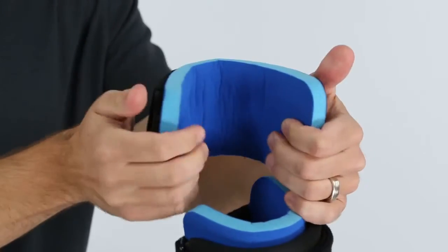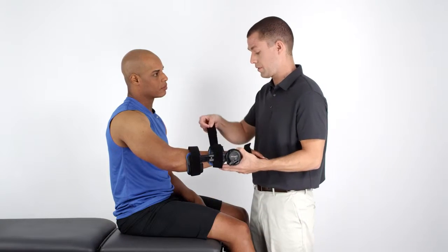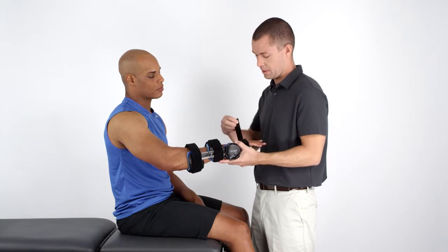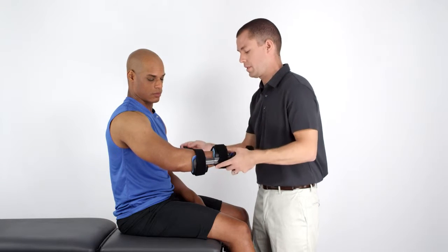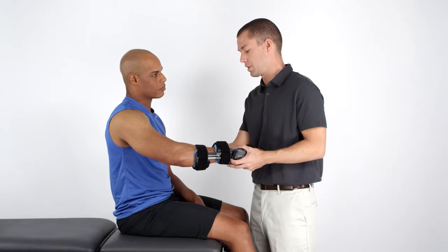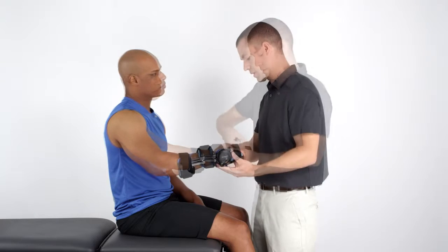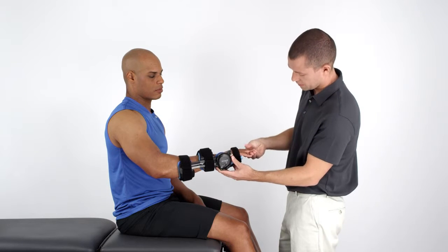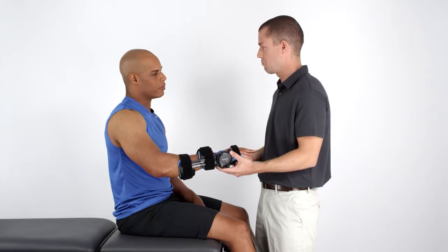Once you've adjusted and positioned the orthosis on the patient's arm, you need to secure the straps. If you removed the straps during the initial fitting, reattach them by locating the buckle on the leading edge of the cuff so that the straps are pulled across the open ends of the cuffs. The straps should be snug enough to allow one finger to be inserted between the strap and the skin. When the device is secure and the patient is comfortable, check for any neurological or vascular changes. The patient should not experience any numbness or tingling while wearing the orthosis.